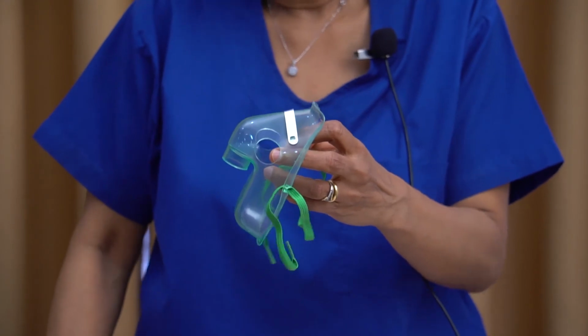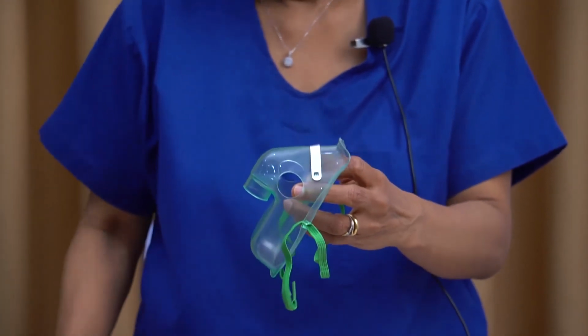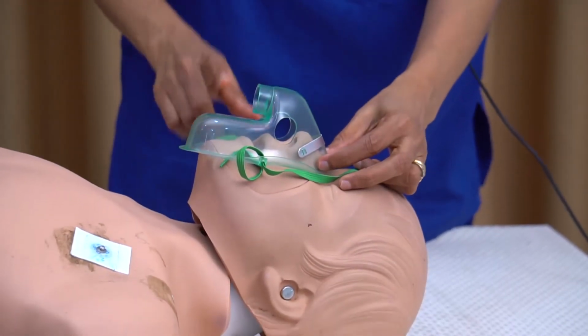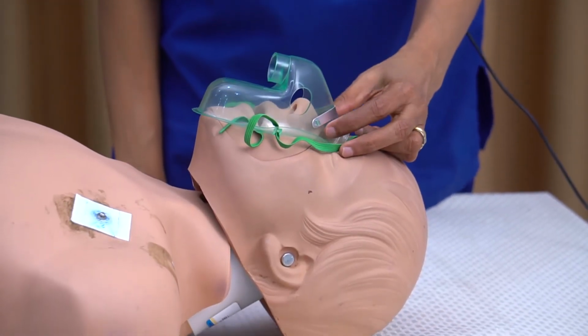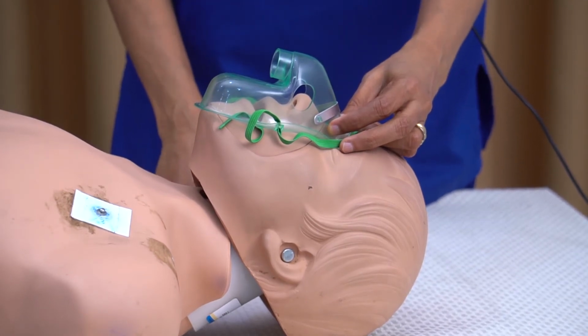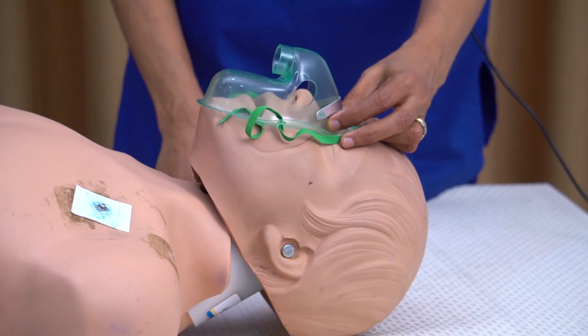This is called a Hudson mask. It need not be applied close fitting. Depending on the flow rate you apply, the patient gets a FiO2 ranging from 24% to about 40%.